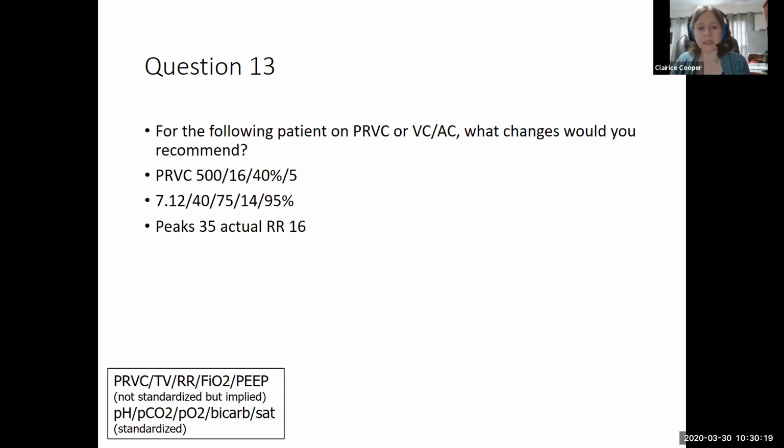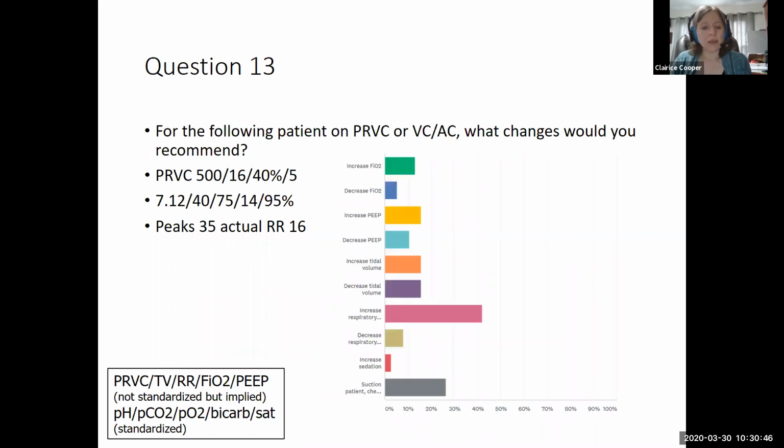Is the patient bleeding? Is the patient septic? Sure, there can be other causes of metabolic acidosis, like diarrhea, renal failure, or pancreatic fistula. However, your top priority should be looking for bleeding or sepsis. That being said, in the immediate setting, you still can help to optimize the patient with the ventilator. So you can see this was a little trickier for the students.